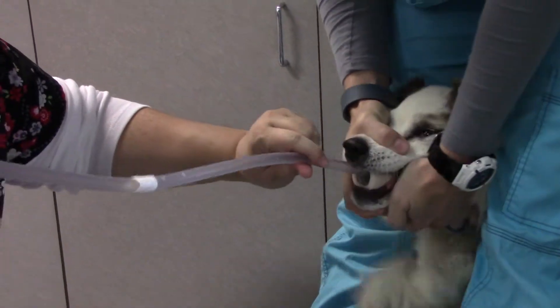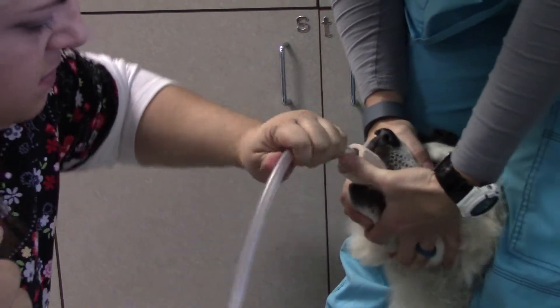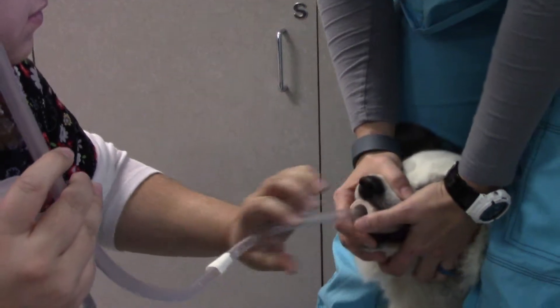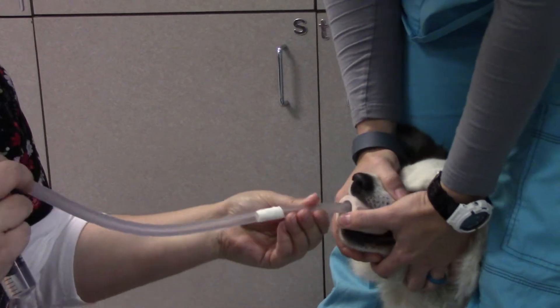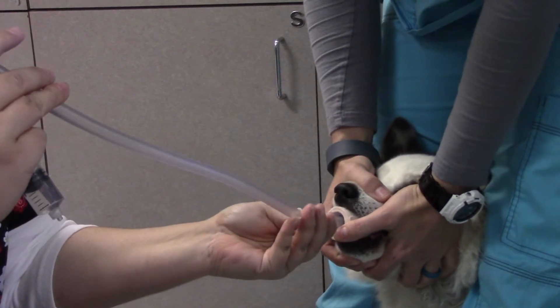Shhh. Andy. Hey, hey. You're all right. Good boy. I know. You feel like you're going to vomit. It's fine. Good boy. Good boy. Good boy, Andy. Almost there.